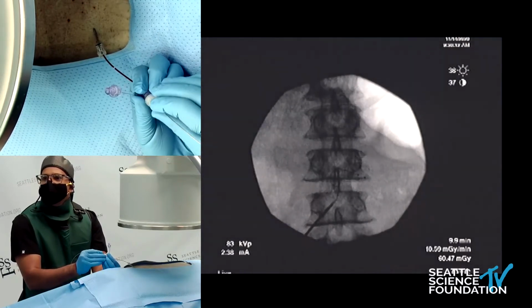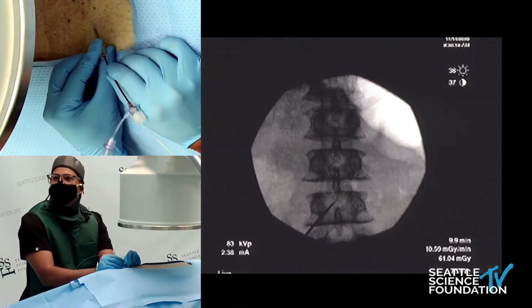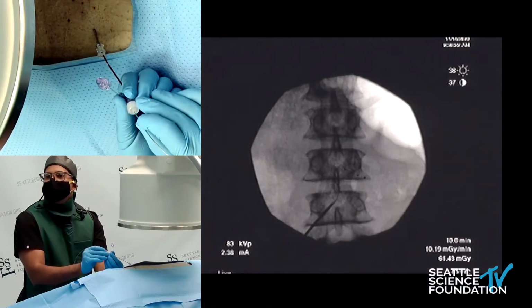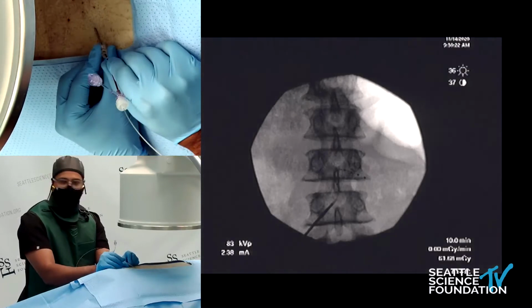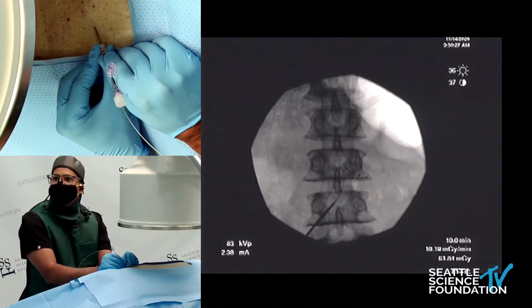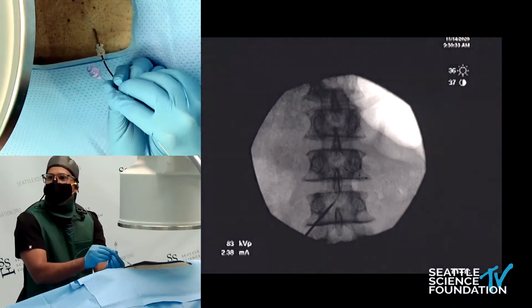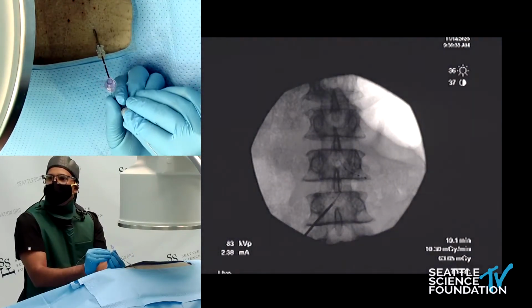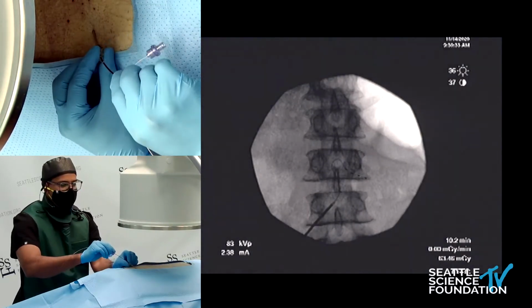So there is something blocking there. I'm going to pull the lead in a bit, and I'm going to drive it up a little bit further. I'm going to pull that lead back in because I'm not getting quite the caudal loop I want. I'm going to take this sheath up more towards the midline here, and now advance my lead a little bit and pull the sheath down. So that looks fine.